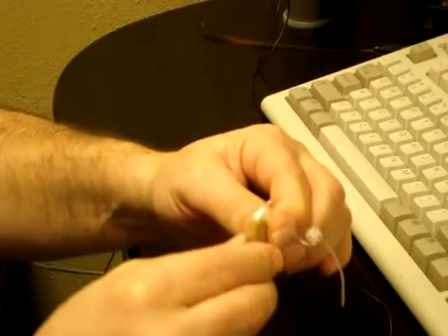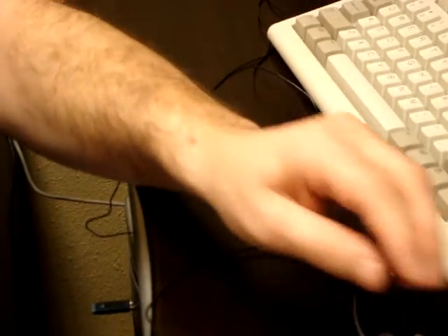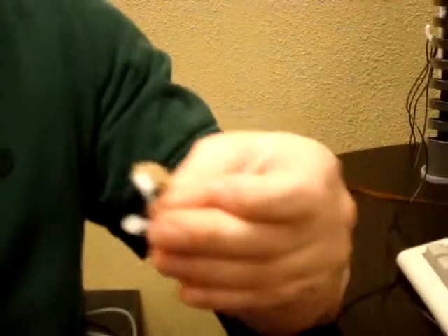So if you take the hearing aids, you can just detach them from the cables. Okay, the easiest way to put the hearing aid on is to put it over the ear first so it's sitting, and then you can just slide the tubing into the ear canal, and there's a little retention cable. You just put it in and it's comfortable.